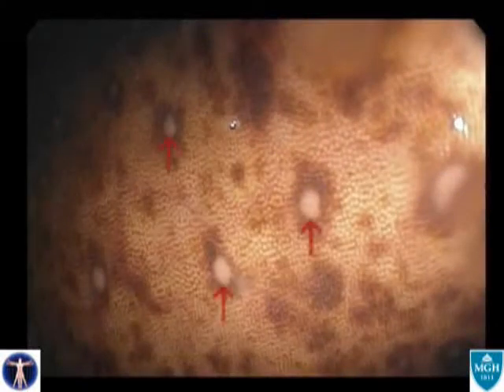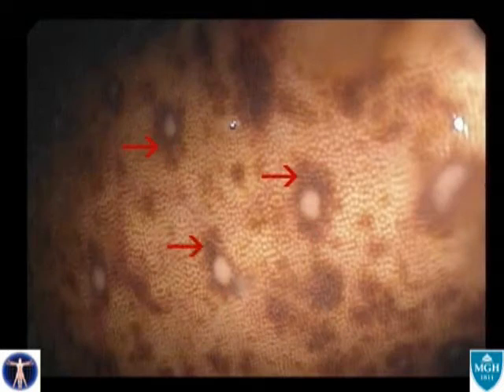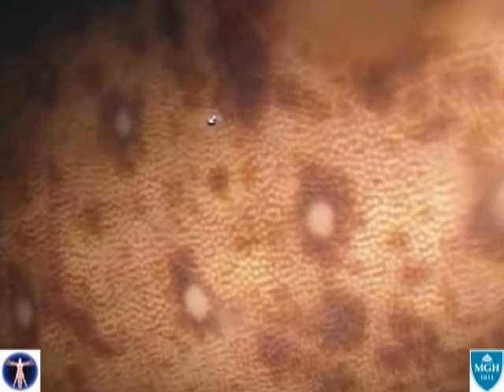Thus, returning to the endoscopic picture, we now understand that the pigment-free areas here are the lymphoid aggregates, and that the surrounding brown halo is comprised of pigment-laden histiocytes. Furthermore, with magnification, we can appreciate this geographic pattern of white dots, which we know are the epithelial pits. The brown staining around the pits represents lipofuscin-laden histiocytes in the surrounding lamina propria.